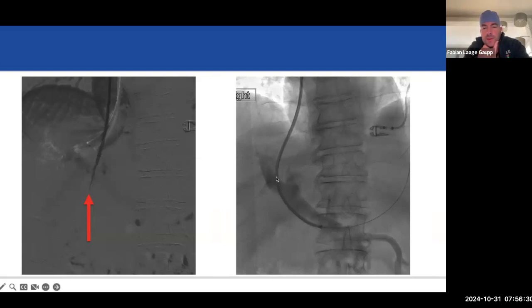So typically the stent that we use is called a Viatorr, with 2 centimeters uncovered, and the total length can be anywhere from, I don't know what the shortest one is, maybe 4 centimeters or so, all the way up to 8, 9 centimeters. I'm not sure how long they make them, but you essentially want the covered portion to cover all of this, and the uncovered portion to be here within the portal vein.